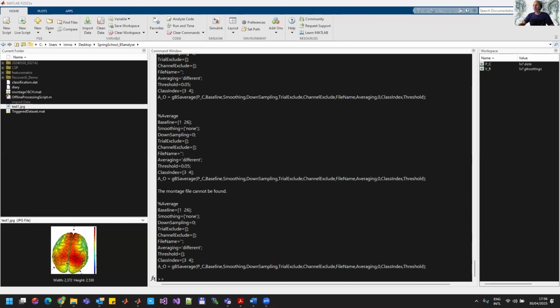Federico is asking, have you given a thought to action observation with motor imagery, like Rizzolatti, observing a monkey who was initially observing another person moving, and this triggered the mirror neurons? Sorry, I didn't get the full question.